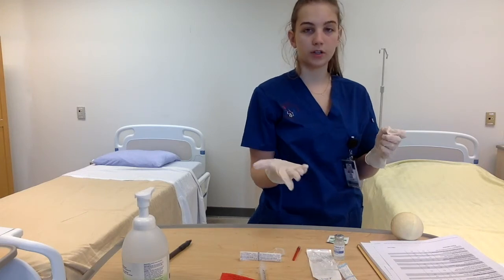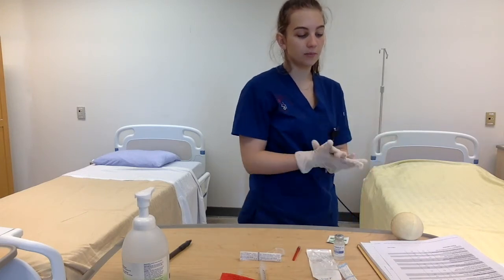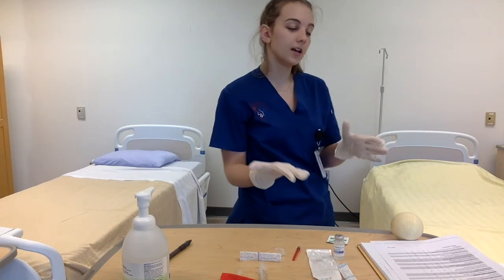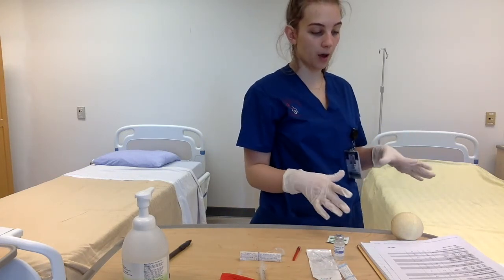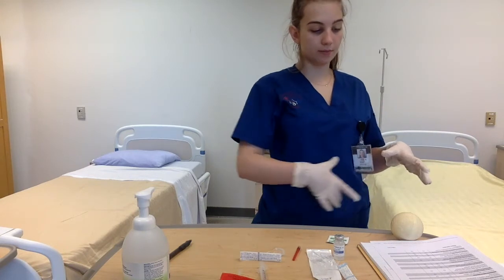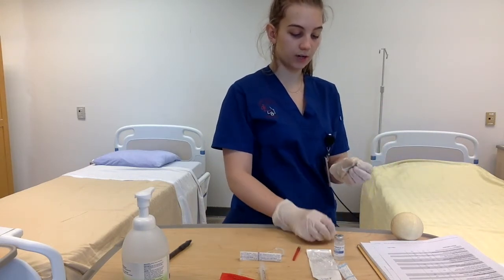So first I'm going to just explain the procedure to the patient. Okay, so Mr. Mancini, today I'm going to be giving you a couple of injections. So the first one is a subcutaneous injection, and for this one I'm going to be giving it on your abdomen. So I'm just going to properly landmark. So it's going to be below your waist but above your hips, so it'll be in this region of your abdomen. And I'm going to cleanse the area beforehand, so I'm just going to use an alcohol wipe.